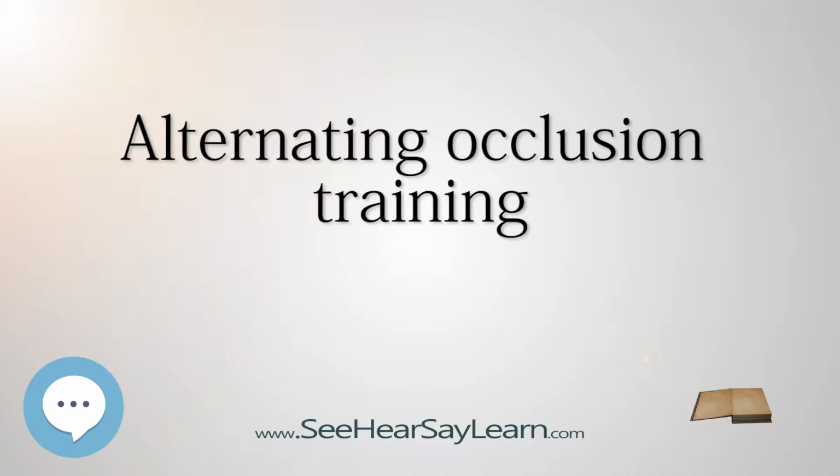Alternating occlusion training, also referred to as electronic rapid alternate occlusion, is an approach to amblyopia and to intermittent central suppression in vision therapy, in which electronic devices such as programmable shutter glasses or goggles are used to block the field of view of one eye in rapid alternation. When performing alternating occlusion training, the person wears the occlusion goggles continuously for several hours while performing regular everyday activities.